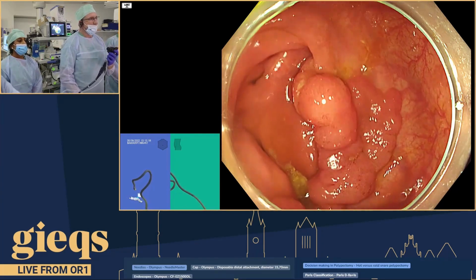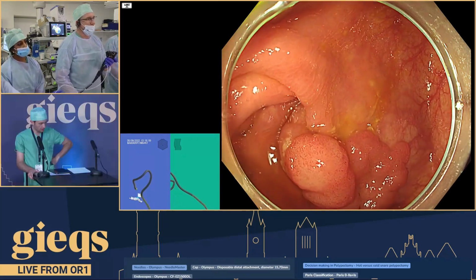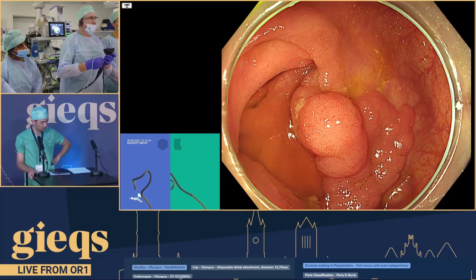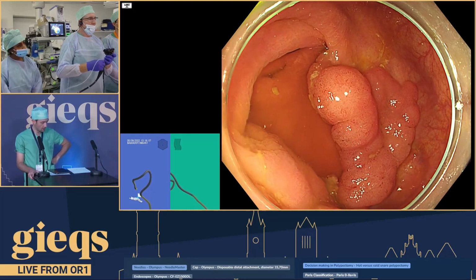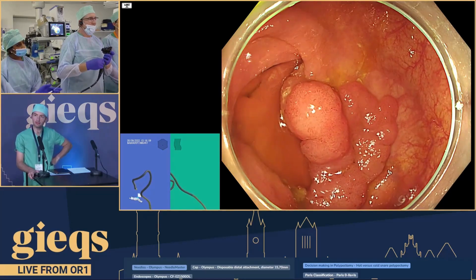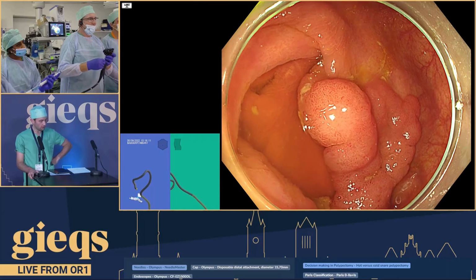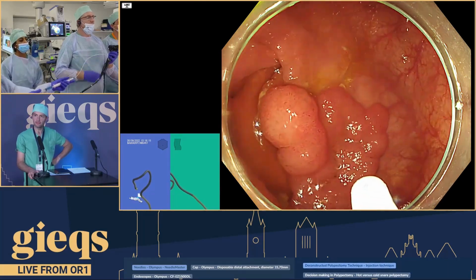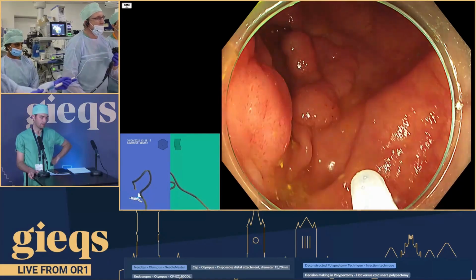So, Michael, in this session, we got multiple 2 or 3 minute presentations on injection techniques, snare placement, Nick joining for defect assessment. And we'd like to end with you doing the thermal ablation. So I wonder if you could just first take us through injection technique, and then we'll come back to you to do the next bit. Okay, all right. So the first question is where to inject.